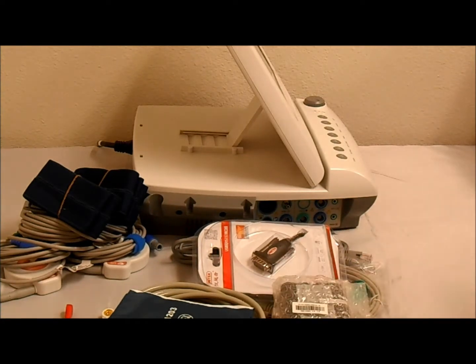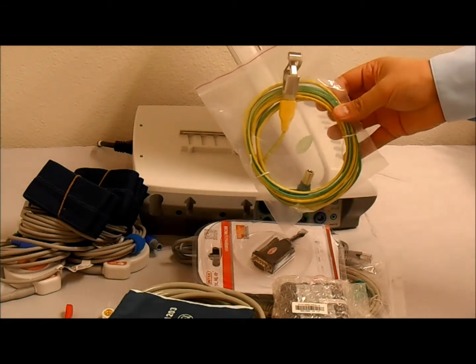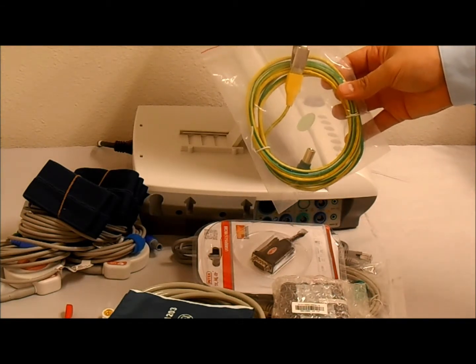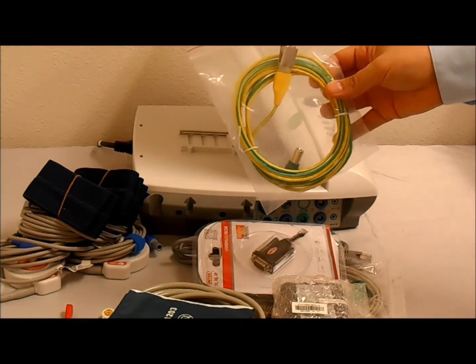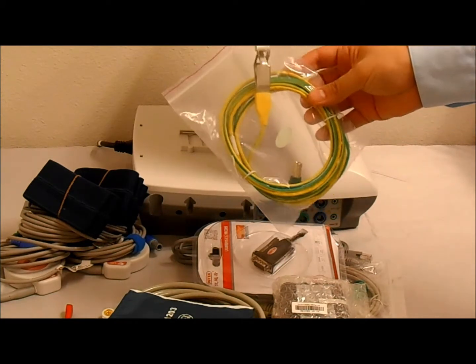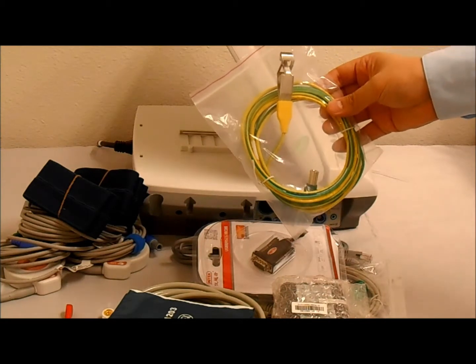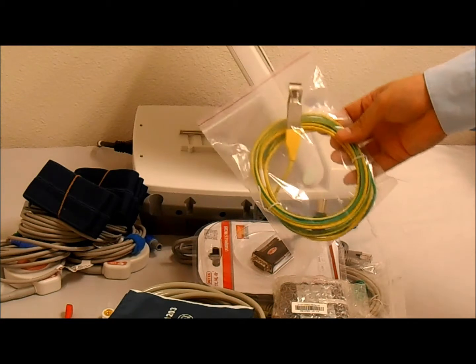And finally, we have this yellow and green cable. This is your grounding cable. In case your facility is next to a radio station, or if there's a lot of radio-frequency interference, if you use this cable and ground the monitor, it'll buffer out that interference. So again, this is only used if necessary.